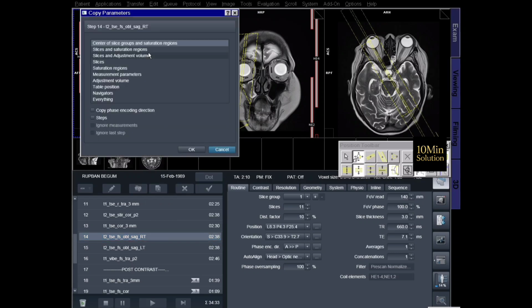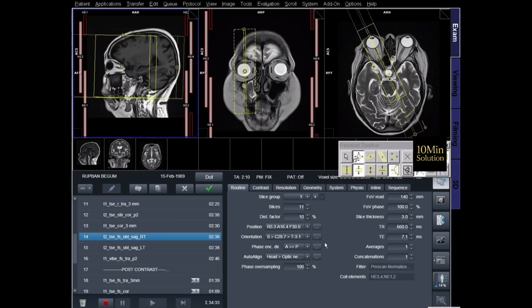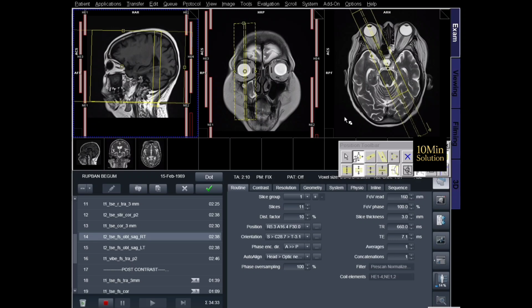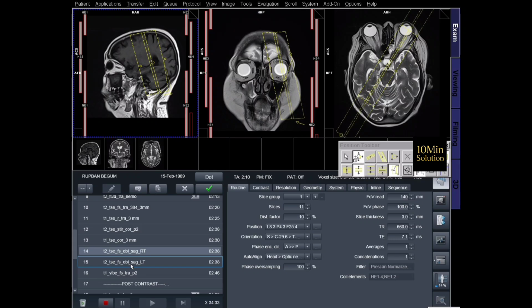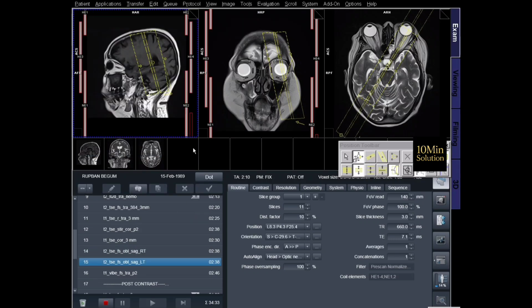Post-contrast T1 fat suppression. If contrast is required, gadolinium-based contrast agents are administered intravenously. After contrast injection, T1-weighted fat-suppressed images are obtained. These sequences are very useful for identifying tumor enhancement, inflammatory changes, vascular lesions, and optic nerve enhancement.